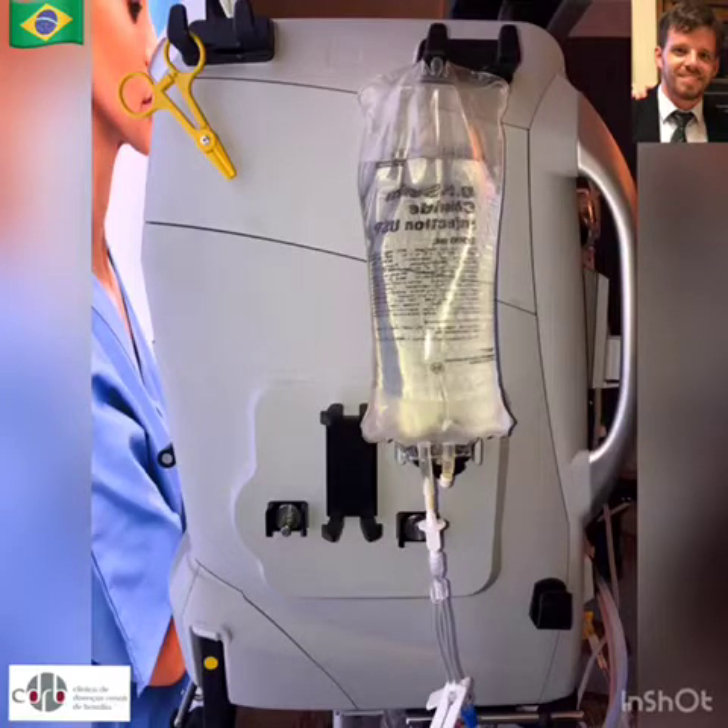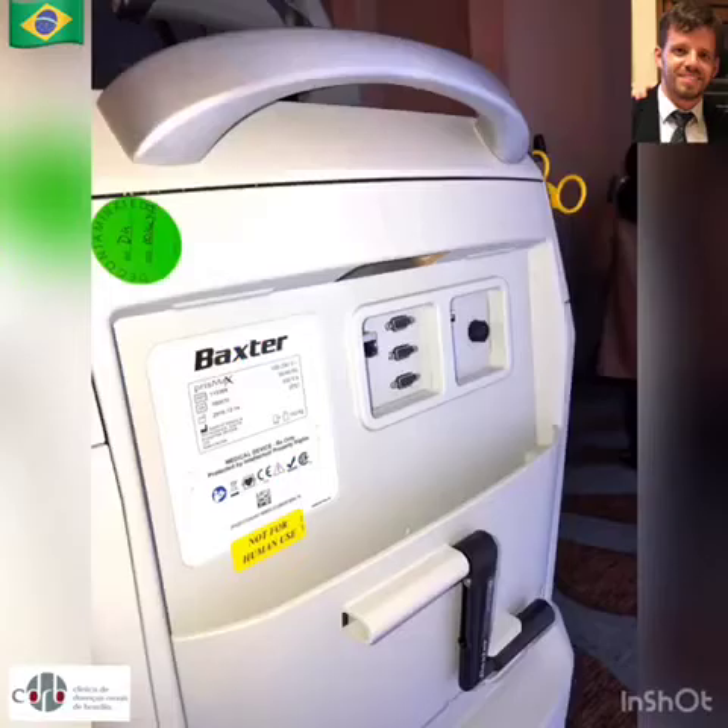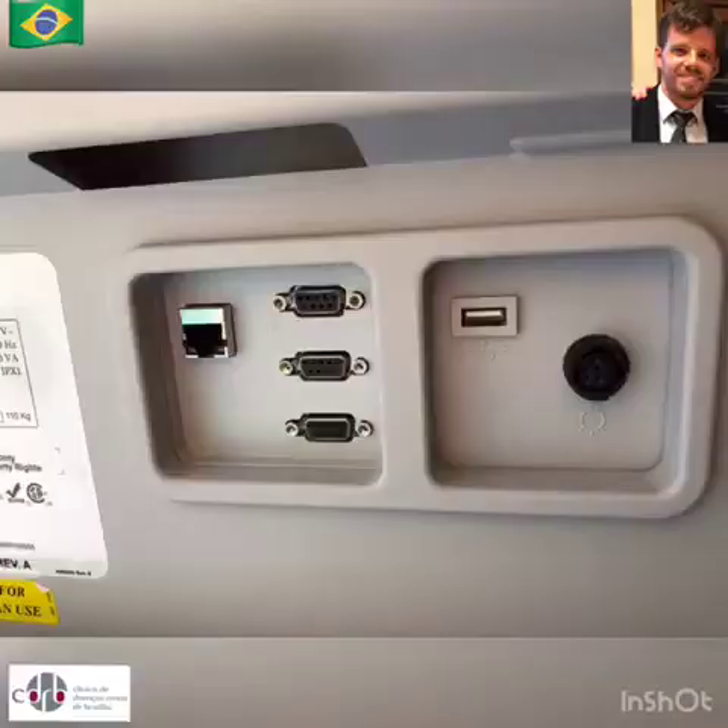Here you can see the machine without this optional device. There is a barcode scanner for patient and machine parts scan, and a USB port on its back, which facilitates data collection.